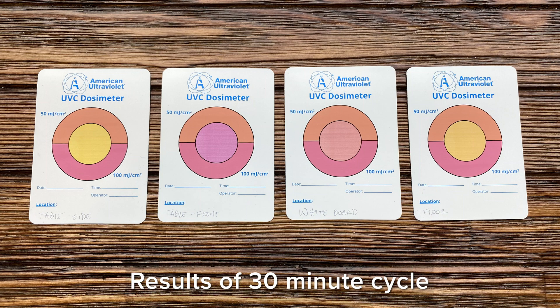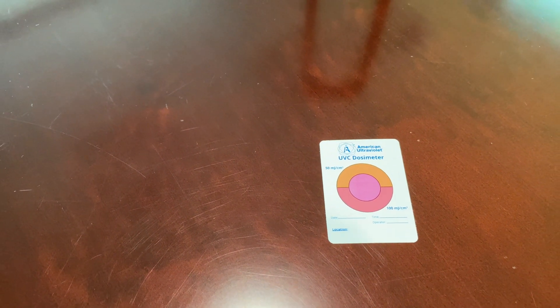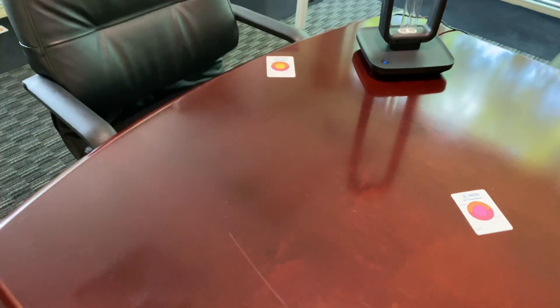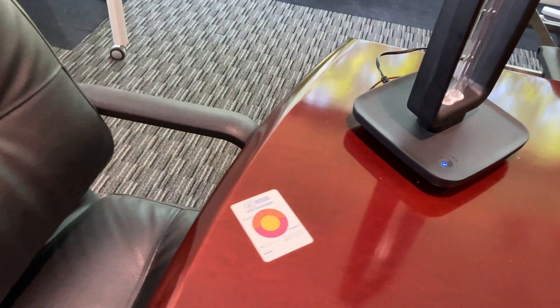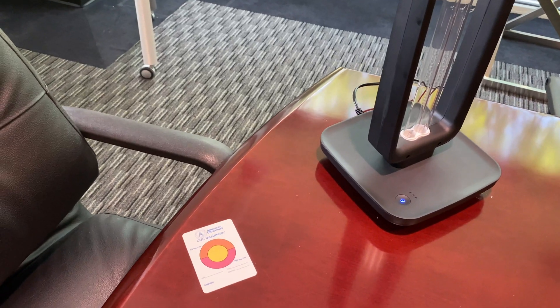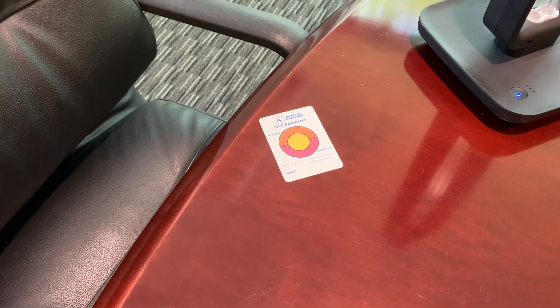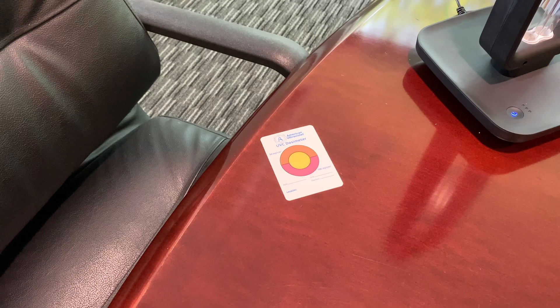We've finished the run cycle on this ultraviolet fixture and now we'll take a look at the dosimeter cards. You can see that this first card turned pink in the center, indicating that it had the highest level of UVC exposure. This card that was on the side of the unit and in the shadow of the support structure was not exposed to enough ultraviolet to turn the center from yellow even to orange — the lower dosage level.